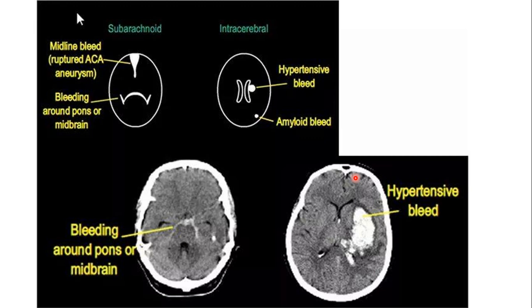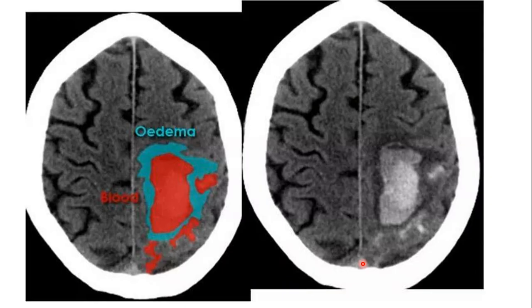Bleeding can be either intraparenchymal or subarachnoid hemorrhage. The intraparenchymal component is surrounded by brain parenchyma, while subarachnoid hemorrhage is seen in the subarachnoid spaces — over the cerebral sulci, at the midline, over the falx cerebri, at the quadrigeminal cistern, and other cisterns at the base of the brain. You can see at the prepontine cistern a density indicating subarachnoid hemorrhage, while the intraparenchymal hematoma here is extending into the adjacent lateral ventricle — intraparenchymal hematoma with intraventricular extension.